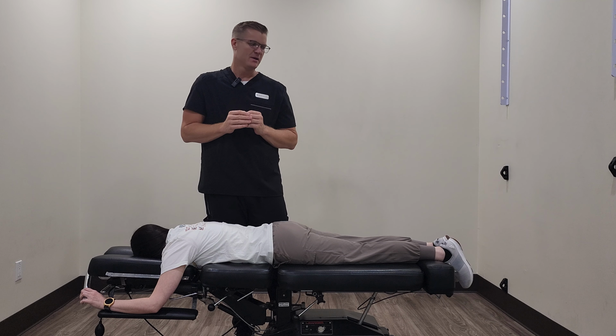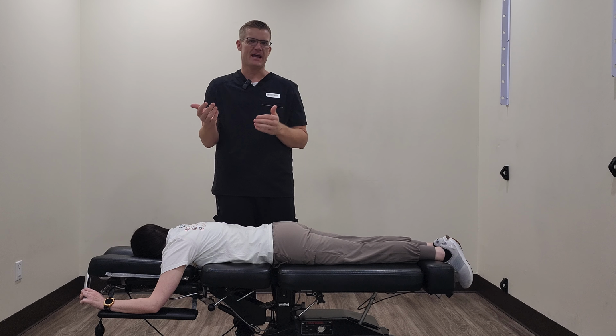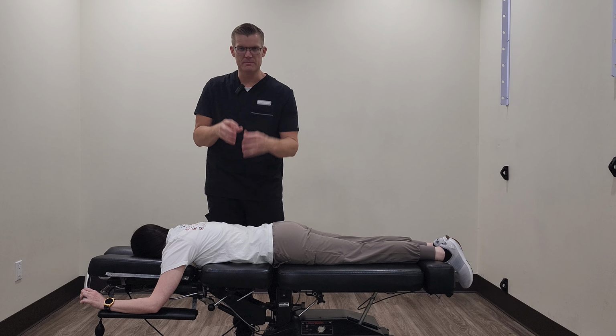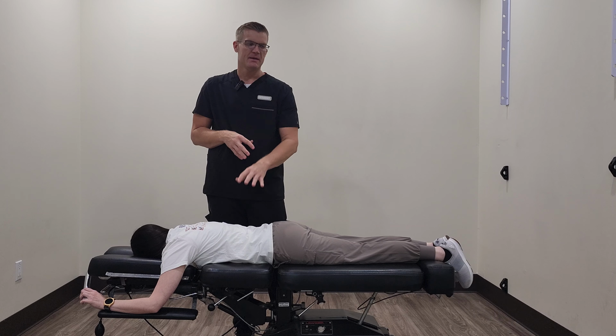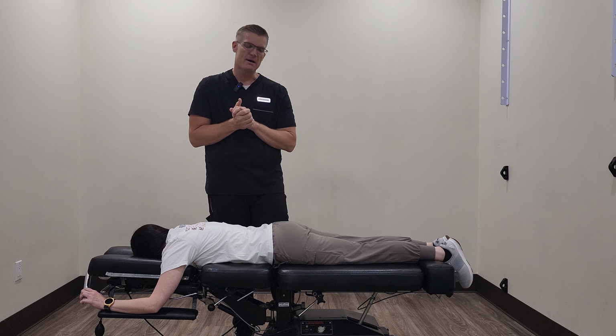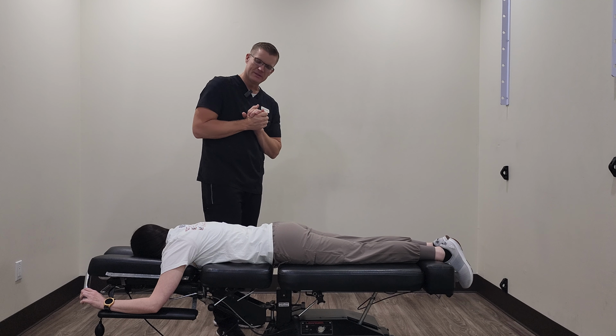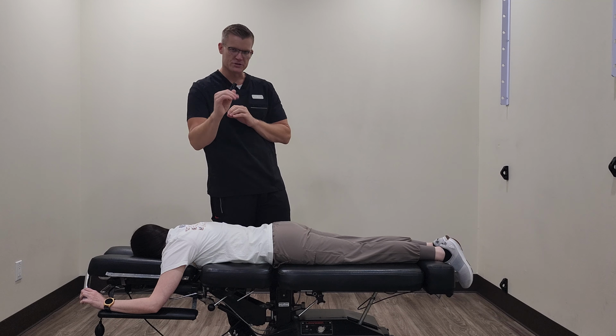Now, does a disc magically pop back in? No, it does not. But this helps that disc have the opportunity to heal itself from inside out. And this also helps to stretch and traction out the muscles, ligaments, and tendons of the spine to help provide some relief. Paired with the other appropriate care, we get some phenomenal, fantastic results. But with this technique, we utilize a special type of table, which I'll show you now.